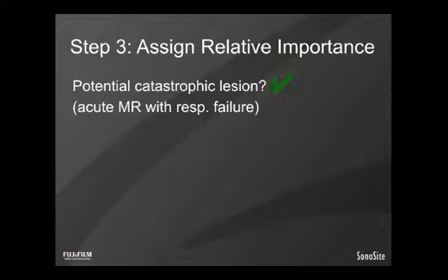We've identified that we believe there's a potentially catastrophic lesion associated with severe clinical trajectory of bilateral airspace disease, which seems unlikely a patient would have pneumonia, ARDS, and severe mitral regurgitation from a clinical point of view. So we have to then reconsider the diagnosis, especially now with a basal septal aneurysm, that likely this patient at some time actually underwent an ischemic event.